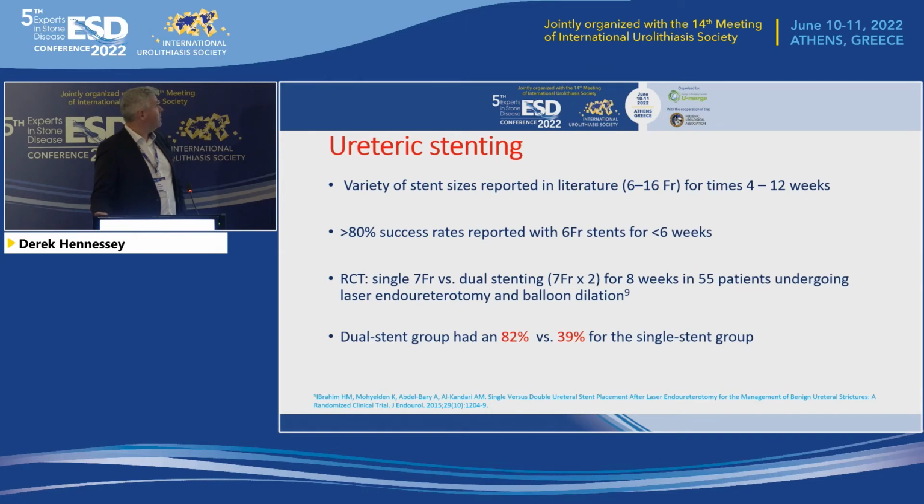The question now that most people have: what about stenting? How big should the stent be? How long should you leave it for? And I don't know. After going through all this data, I don't know. Success rates of greater than 80% have been reported with a 6 French stent for less than 6 weeks, while other papers have shown similar success rates with larger stents for longer.